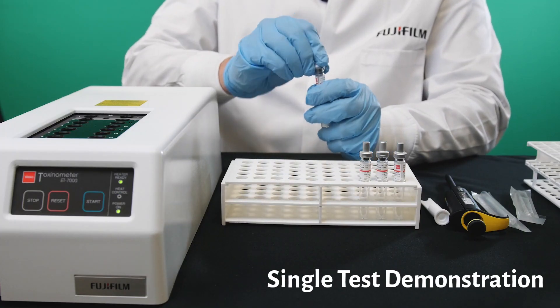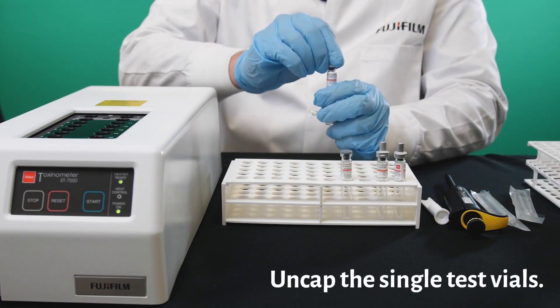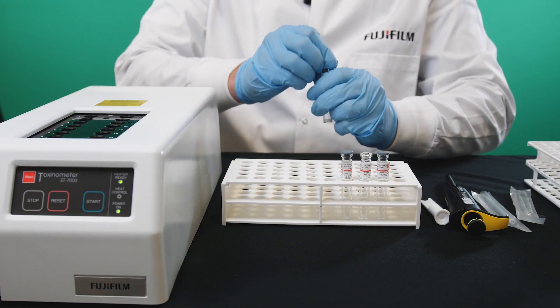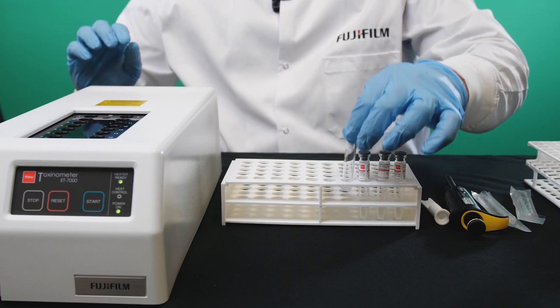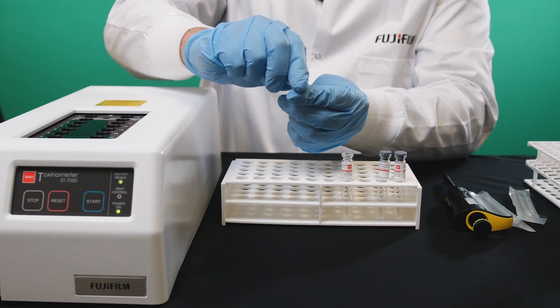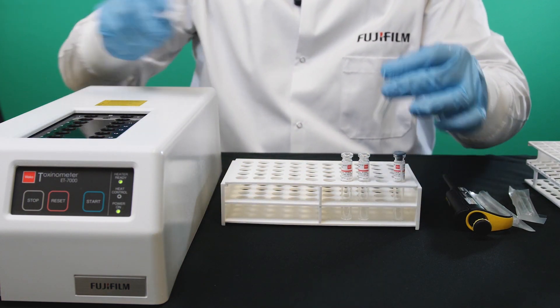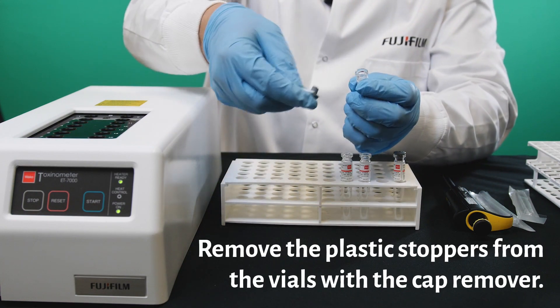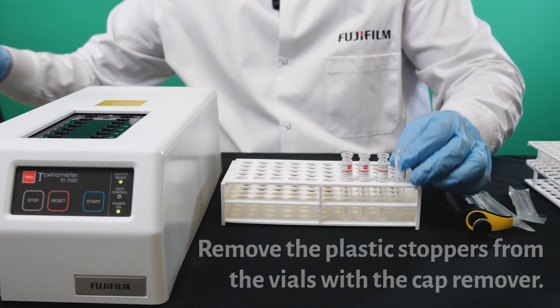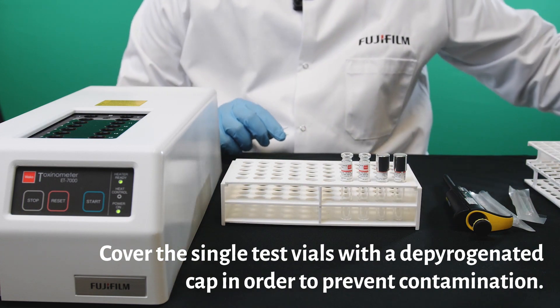At this point, our single test kits — we can go ahead and decap them. For these specifically, you can actually take this cap remover and remove the cap like that. At this point, you would go ahead and cap each of those.